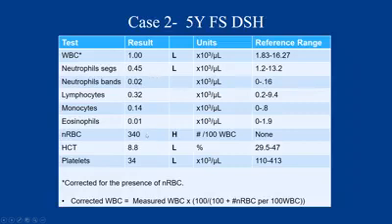So not only is this patient anemic and thrombocytopenic, but it's actually notably leukopenic and profoundly neutropenic. So it actually is pancytopenic. All three cell lines are down, which is very concerning for underlying bone marrow pathology in this patient.